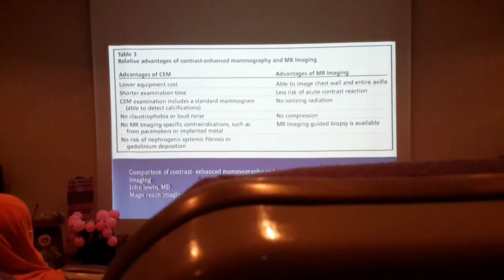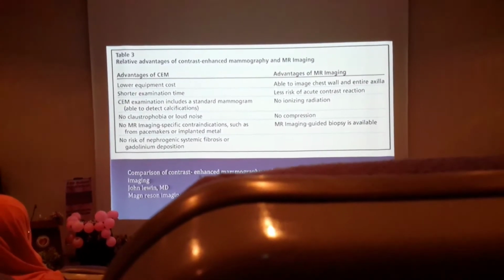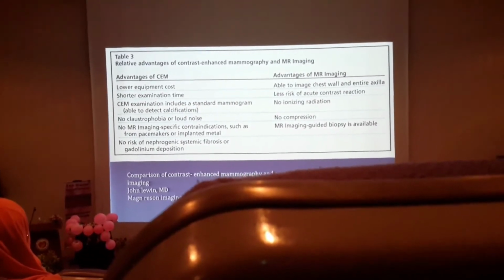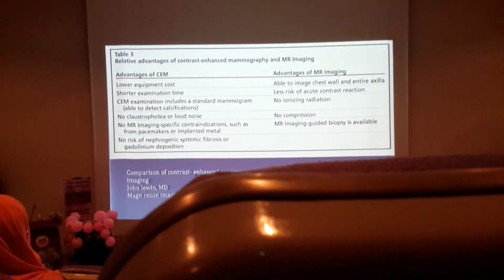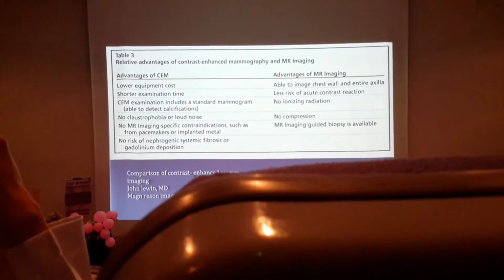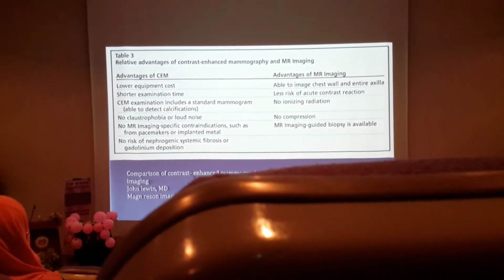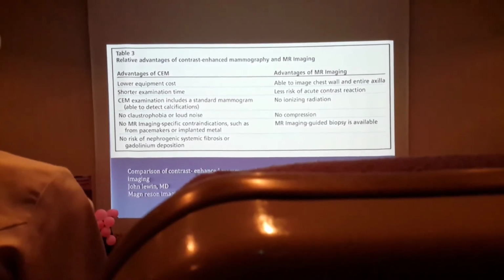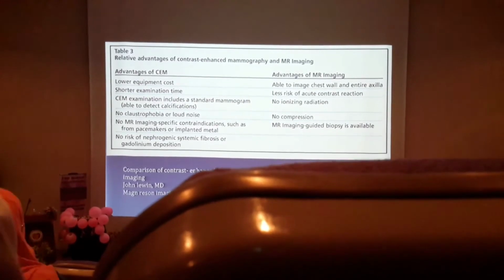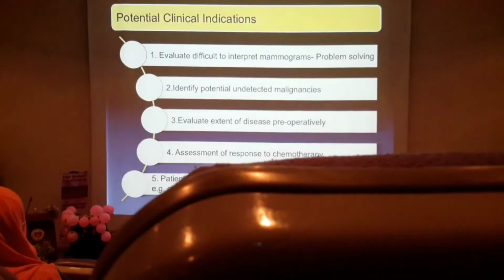So this is some of a recent study done by a friend of mine, John Lewin, and the comparison between the advantages of contrast enhanced compared to an MRI. Well, it's lower cost, shorter examination time, and you can actually detect calcifications because you have a complementary mammogram with you, which is something that you can't do with the MRI. And you don't have any issues of claustrophobia, and even the other MRI contraindications of pacemakers and all don't come into place here. And there's no risk of NSF or gadolinium deposition with contrasted.